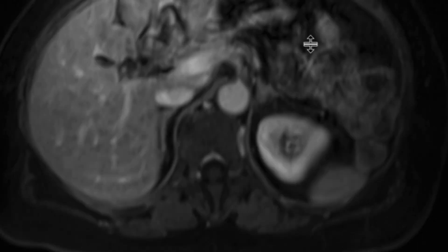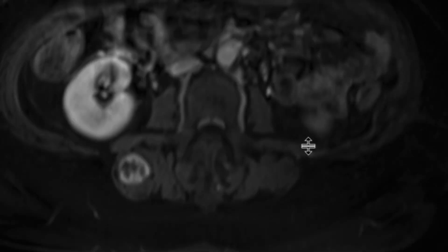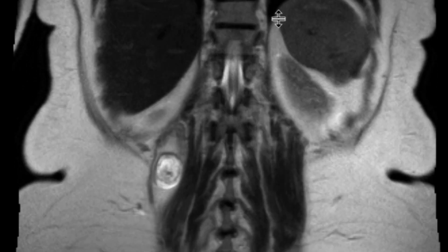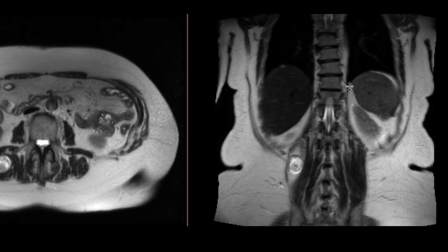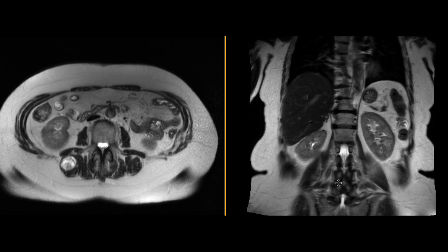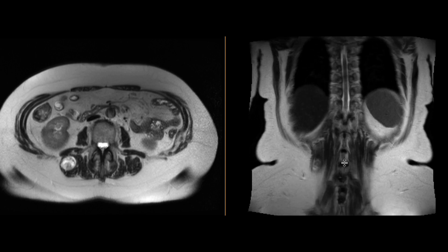On the post-contrast sequence there's some nonspecific enhancement associated with the periphery of the mass in particular. You can also see it on our T2-weighted sequences — it looks pretty similar to what we saw on the axial T2, sort of oval shaped with those ring-like structures of T2 hypointensity within it, and it looks like it's within that paraspinal musculature.